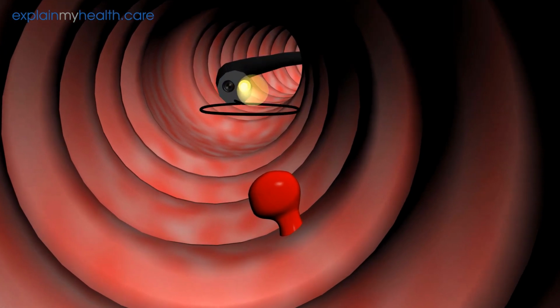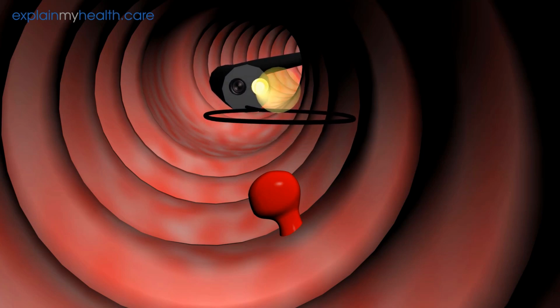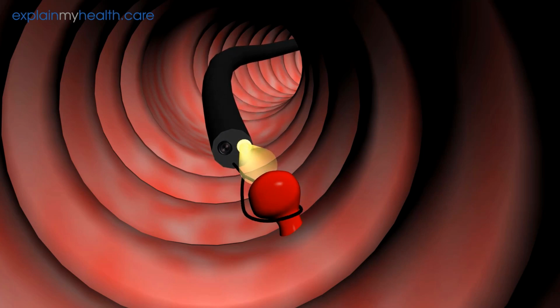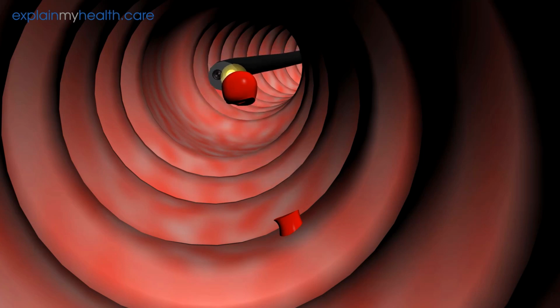A biopsy is when they take a small piece of abnormal-looking tissue and send it to a laboratory to make an accurate diagnosis. In some cases, it may be possible during this same procedure to remove any small growths, known as polyps, or stop bleeding by inserting instruments down the scope.